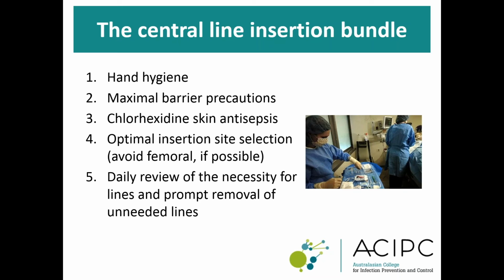The following is a central line insertion bundle recommended by the Institute for Healthcare Improvement. Hand hygiene, maximal barrier precautions, chlorhexidine skin antisepsis, optimal site selection, avoiding the femoral if possible, and daily review of the necessity for lines and prompt removal of unneeded lines. So all 5 of these are equally important in the bundle.